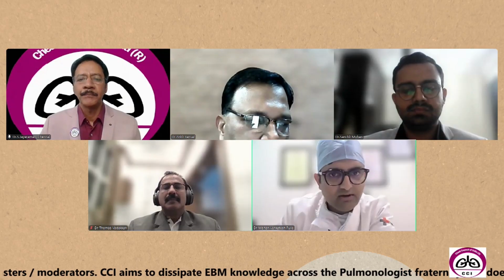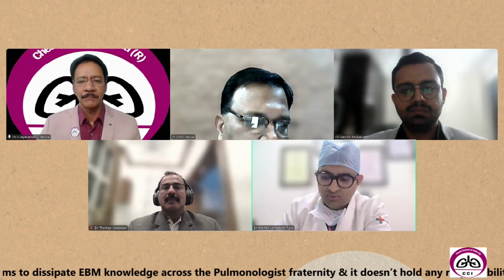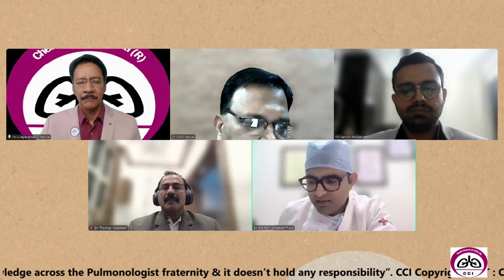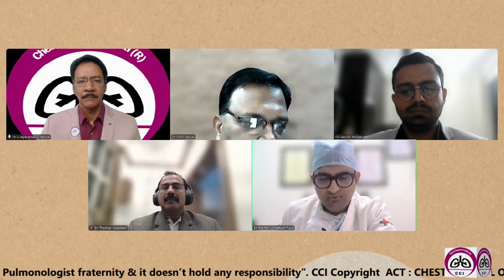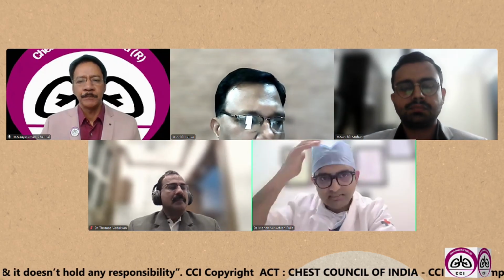Thank you, sir. This we have already discussed in my presentation, but I will explain it again. I will see mediastinoscopy in 3 time periods, we could say. Before the invention of EBUS, if you wanted to do mediastinal staging, mediastinoscopy was the only way you could sample the lymph nodes. And then EBUS came.